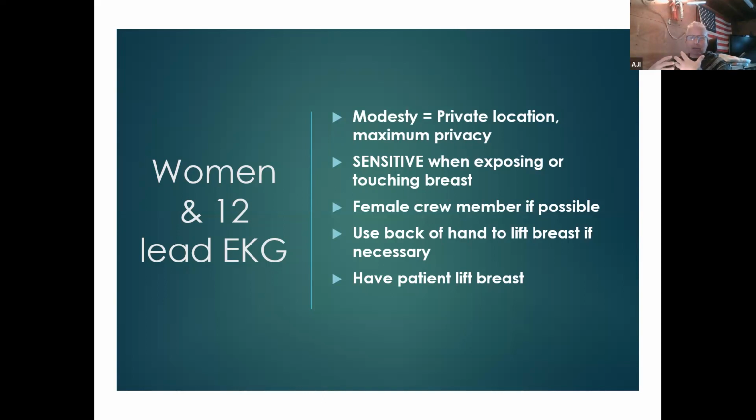So we remain professional and clinical while we're doing this. If possible, have a female crew member do this. Use the back of the hand, or you can have the patient lift the breast themselves. You'll find a lot of patients will not worry about modesty at all.